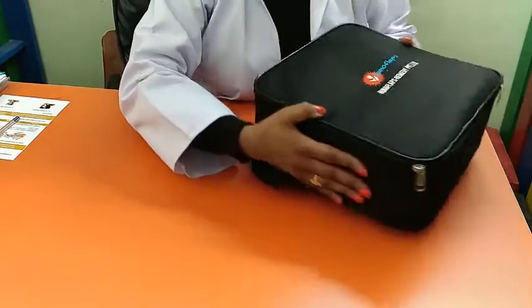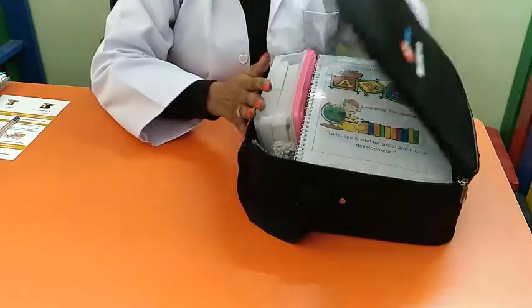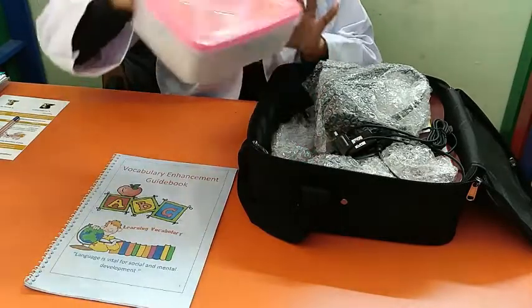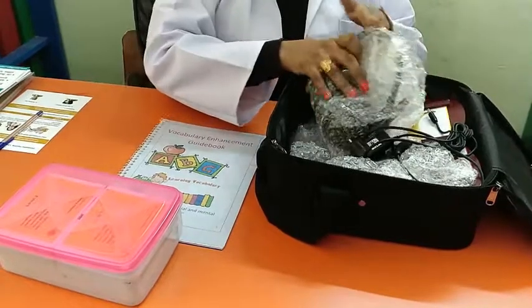This full kit includes the Speechify device with accessories: a vocabulary enhancement guidebook, a systemized flash card kit, and the device itself.